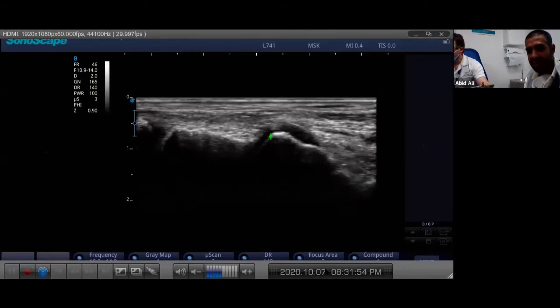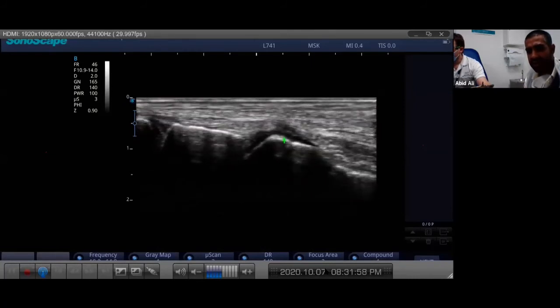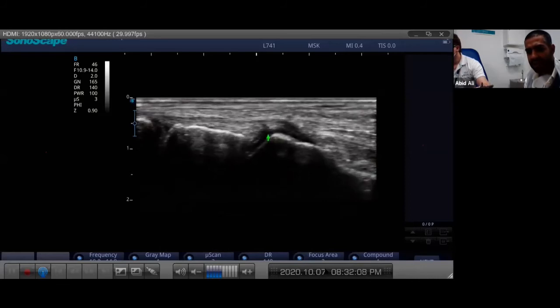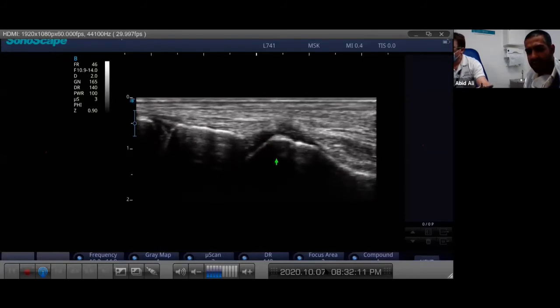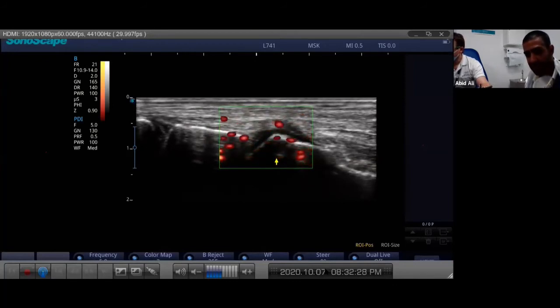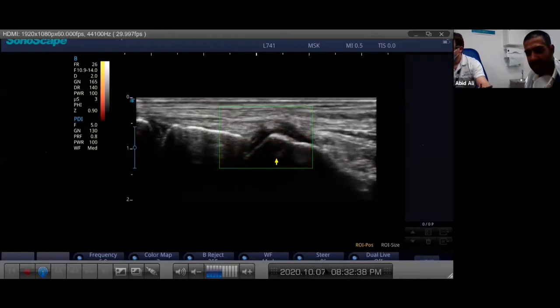Go back into long axis - if you get lost just go back down to the toe and start coming back up again. Now we've gone back to the navicular talonavicular joint. Interestingly, can you see I'm picking up a trace of fluid here over the top of the joint - it's actually coming from inside the joint, tailing down into the joint capsule. We might want to put color flow on here and interrogate to see if there's any signs of increased vascularity - thinking about some kind of rheumatology problem, synovitis, capsulitis.